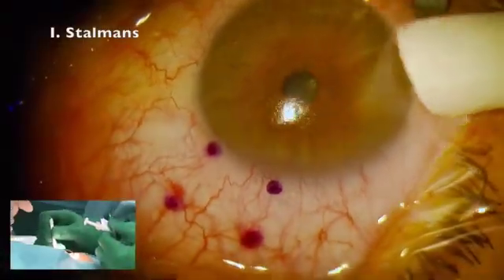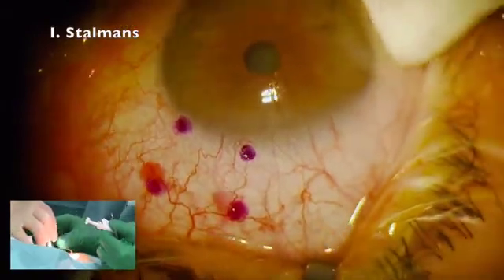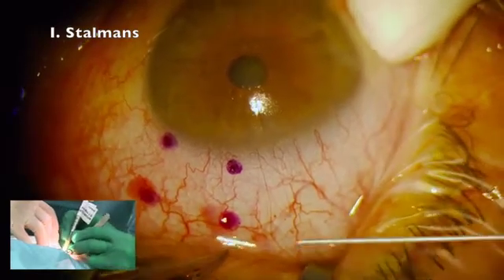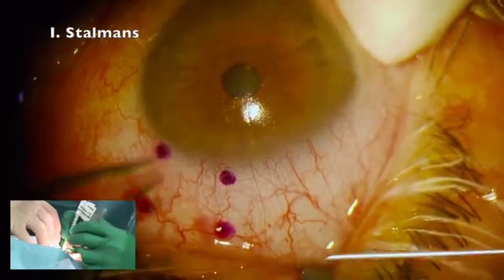Which concentration of mitomycin are you injecting? I use 0.1 milligrams per ml and I use 100 microliters. This is actually half of the concentration that I use routinely for my mitomycin cases.